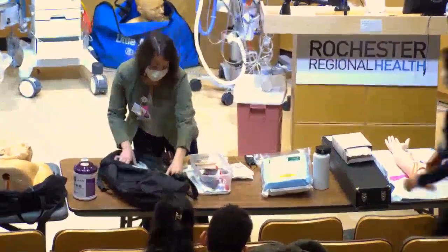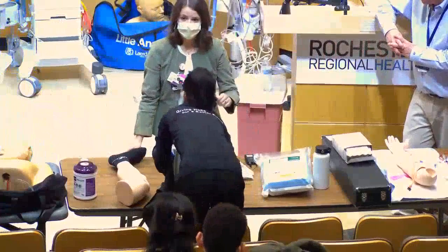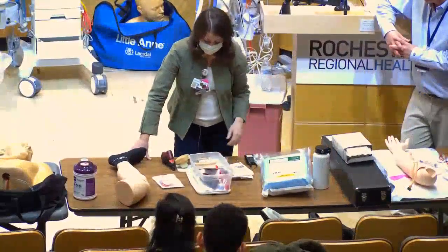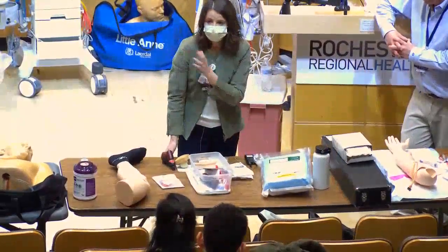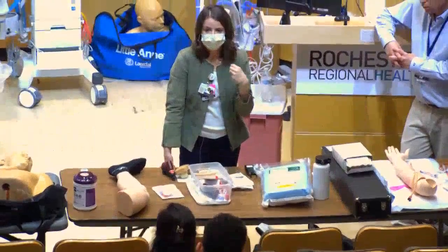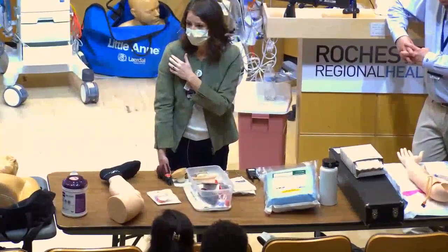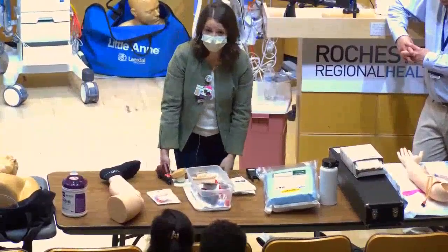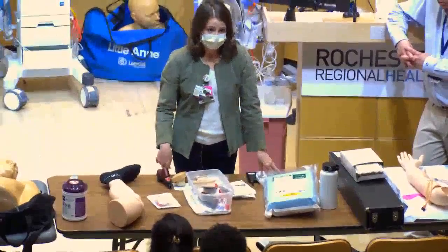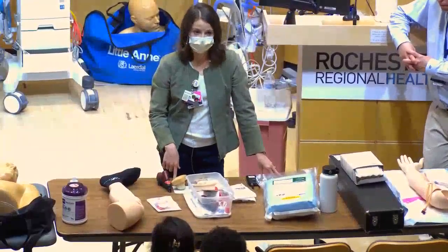There are two IO insertion sites: the proximal humerus and the flat part of the proximal tibia. The preferred site is the humerus because it's closer to central circulation — you can push about five liters per hour through a humeral IO versus only about one liter per hour through the shin. Practically though, during a code with anesthesia and RT at the head and compressions ongoing, the shin is often the easier place to access.